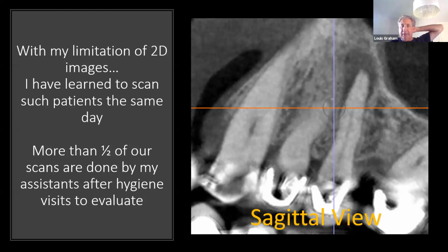I'll do that. Is it 2 canals going into 1 canal? I'll do that. Is it 2 canals separate? I'll do that. Is it 1 canal splitting into 2 or 3 canals? Referral. If it's really curvy and I can't follow it, referral.